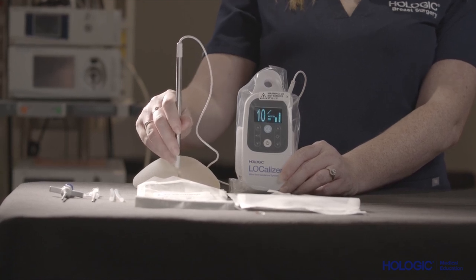After the specimen is removed, the probe can also be used to confirm that the intended tag was removed with the specimen.